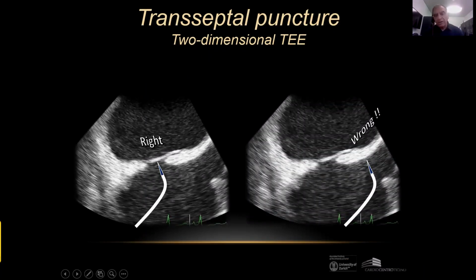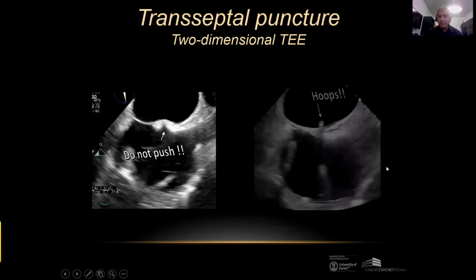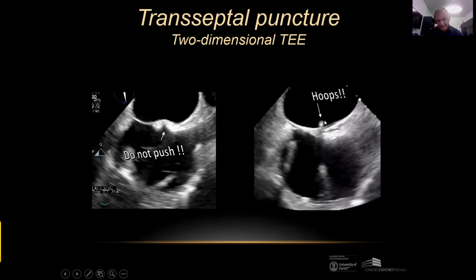Could be okay. It's not very easy, because we do have several cases in which I say, no, you are not in the right position. Do not push, please. Go a little bit down. Do not push here, because you are just pushing the septum secundum. And unfortunately, they push. Fortunately, in many cases, thanks to echocardiography, they just push it with a single needle, and when they go back, nothing happens.